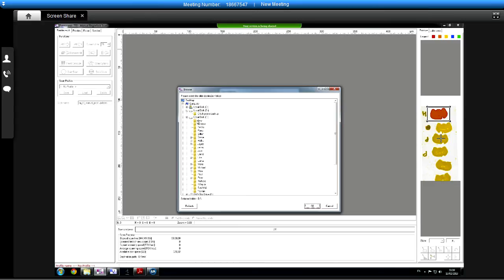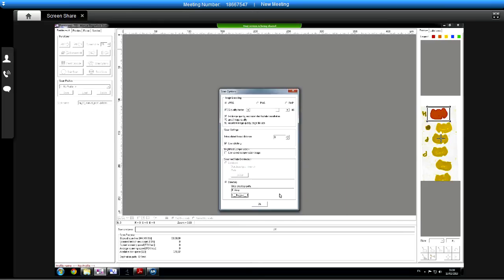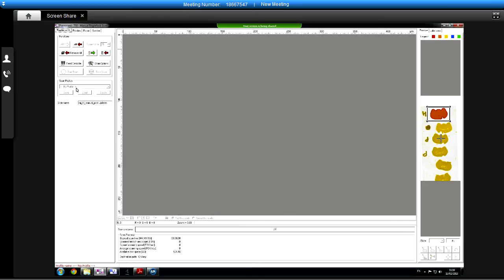And so particular, oh no, that's fine. Okay, let's just... Larissa's a good general one if you want to use that. I guess the number of focus steps is the only thing it will change. Larissa's set to 7. 7 then.